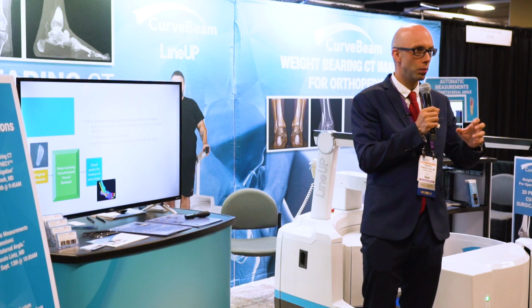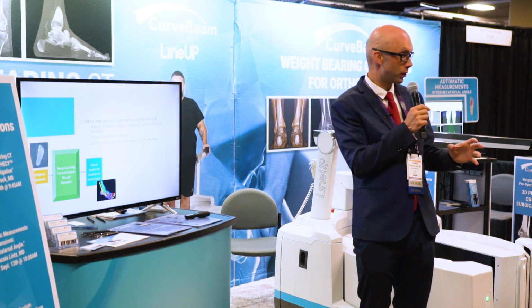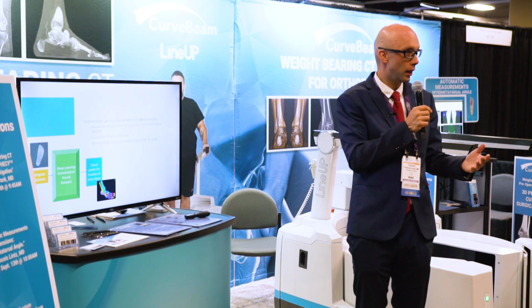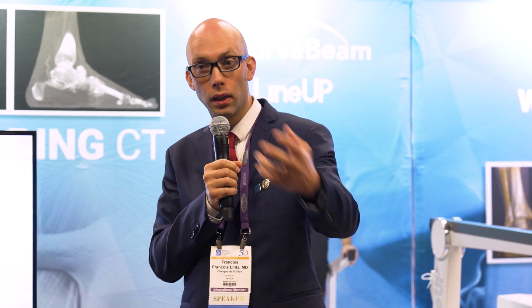But once we've mastered automatic segmentation, we have all the bones and maybe in the future all the tissues, or there's no limit to what we can do and to what we can measure. So now that the algorithm works for this angle, it's going to work for anything that anyone wants to have a look at. It's just a question of time, and it's just a question for the technology to be widespread enough to feed back data sets into the machine learning loop.